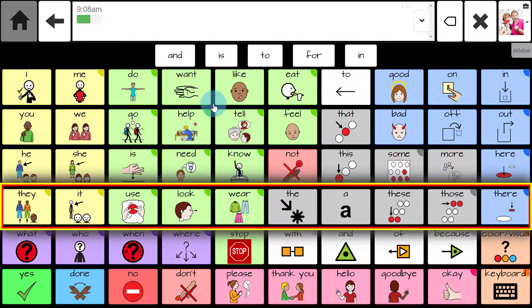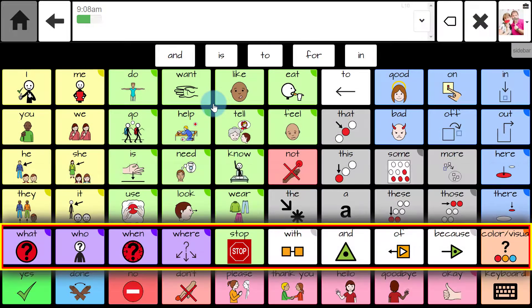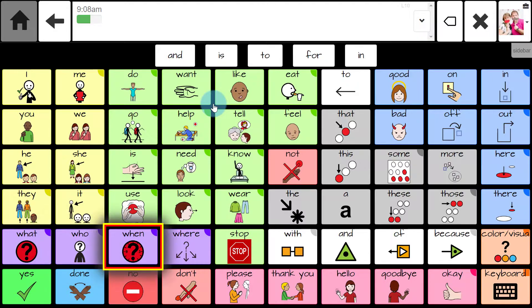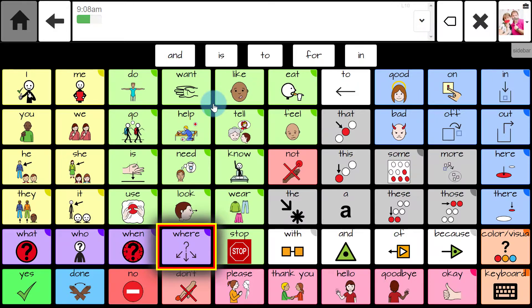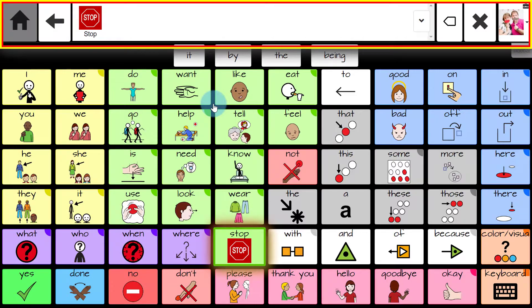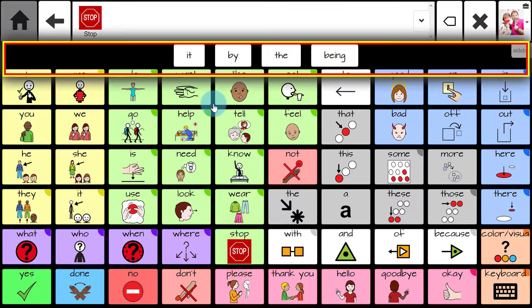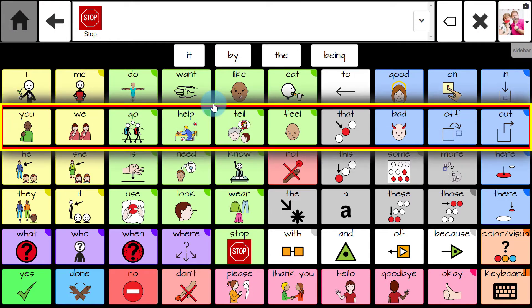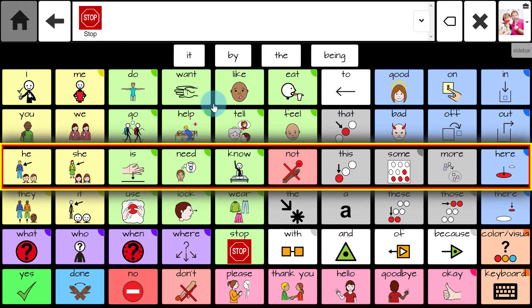Now the system will run using scanning for your user when in speak mode. A highlighted box will move through rows, columns, regions, or buttons. When the user selects one of these areas, the program will then scan button by button within that region so you can select the desired words for speech.